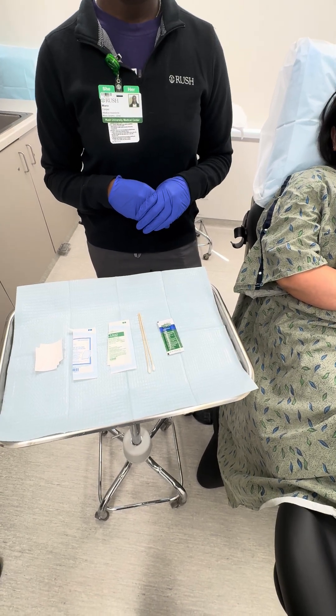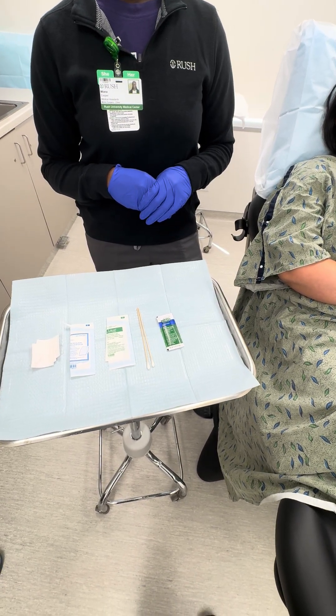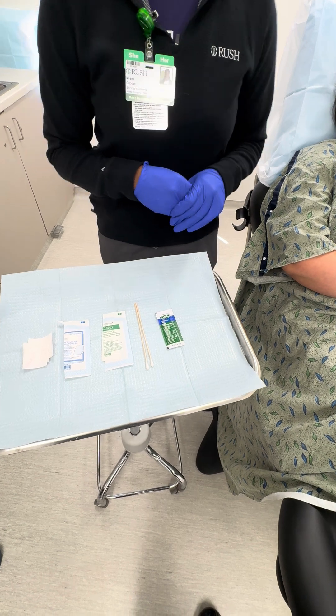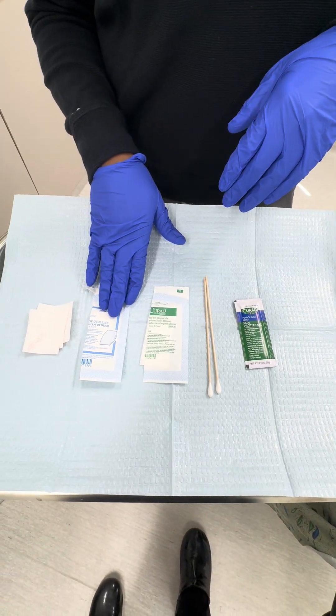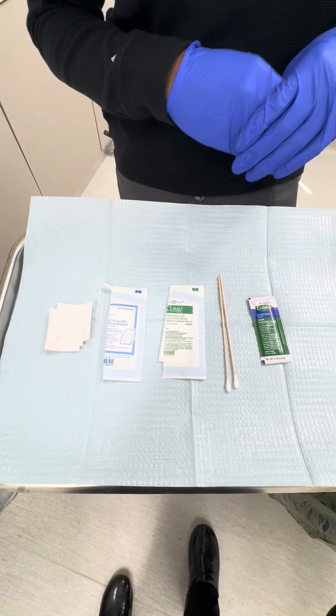In this video, we will review how to apply a pressure dressing after cutaneous surgery. First, we're going to be using a Vaseline, a Telfa pad, and a pad for pressure, and then we'll use tape to stick it on.